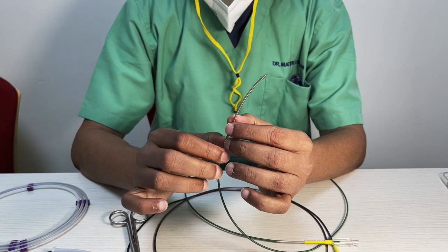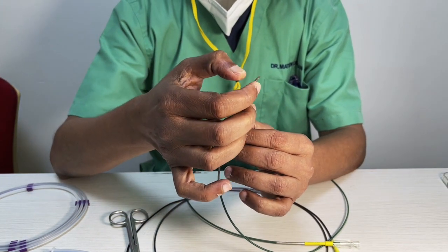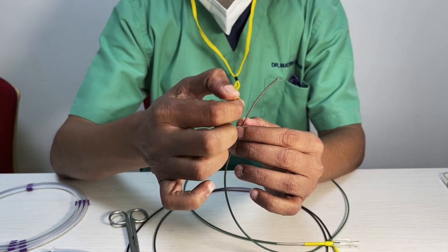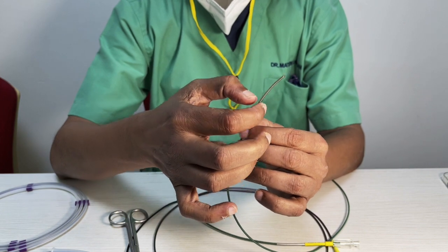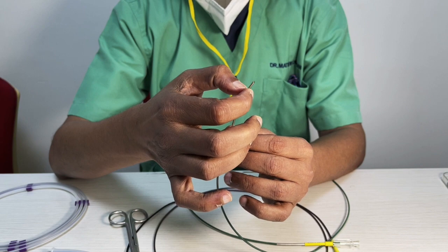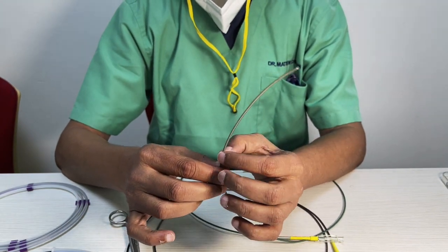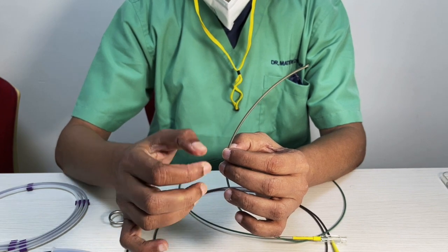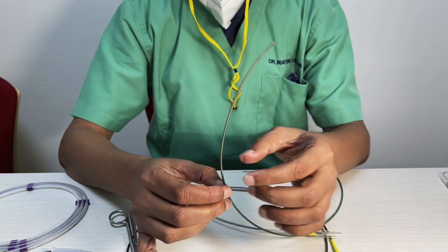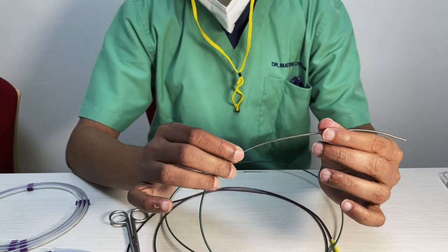So what they did in this product, Neuron, is they have got a platinum marker, which is basically a tight coil. After that, they have got this coil coming, and the pitch of this coil changes. For example, distally, the pitch is 0.008 of an inch, then it becomes 0.004, then it becomes 0.001. So as you come proximally, it gets stiffer because of the braiding.